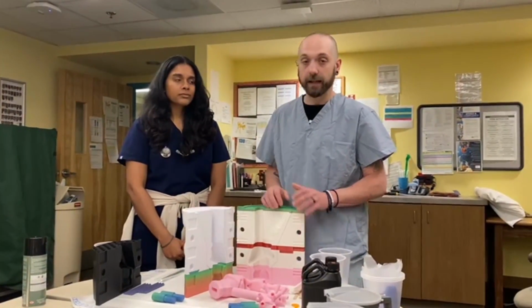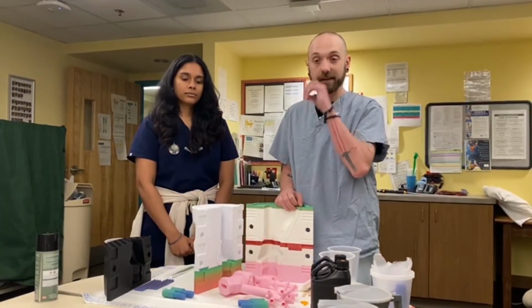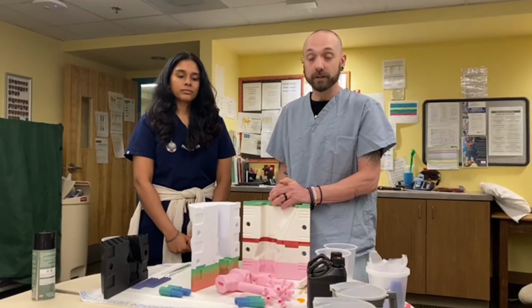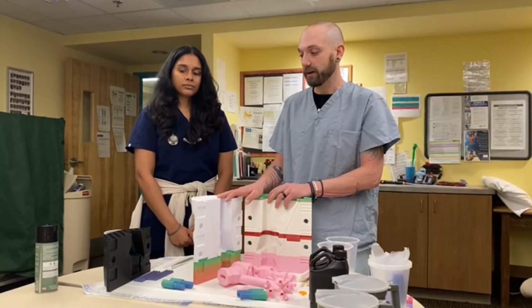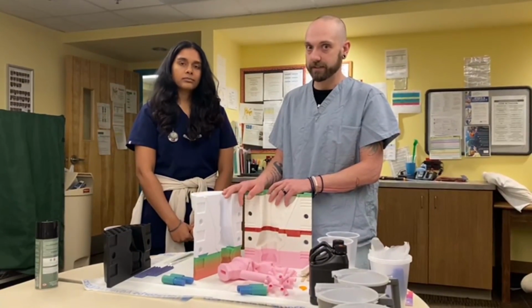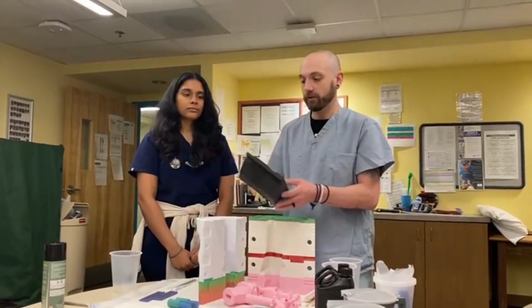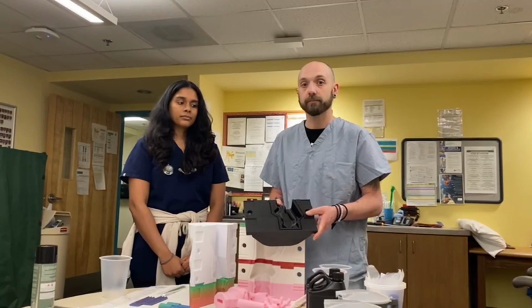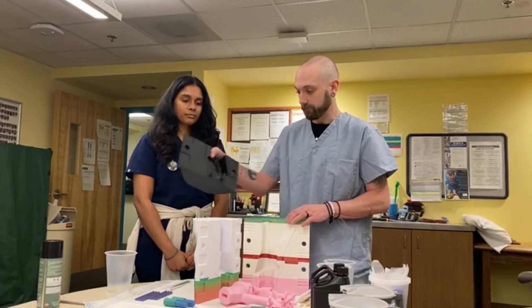It ends up being a 0.2 millimeter layer, 7.5% gyroid infill, and otherwise all just basic settings that come default on any printer itself. We are going to mess around with it a little bit to get it even more detailed with an even finer print.